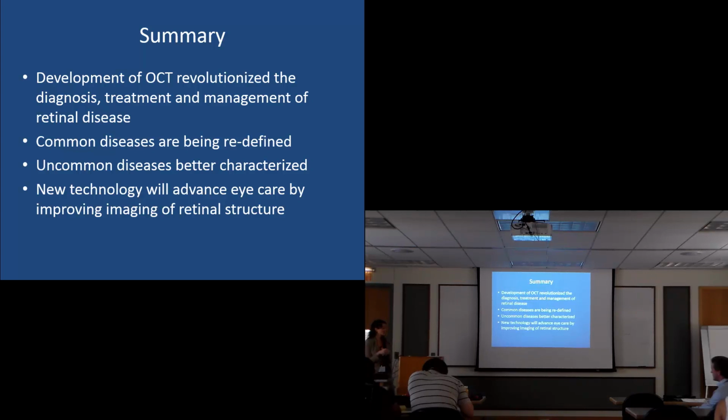Where we need to improve is when we look at these images, we're still only seeing this is 6 millimeters of the back of the eye. We're not able to image really the periphery of the eye. And the degrees that we're looking at, about 50 degrees, the back of the eye is up to 120. We really want to get out further. We want to see what the peripheral retina looks like.